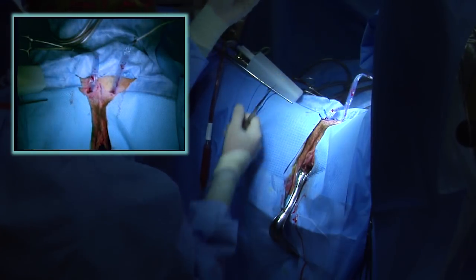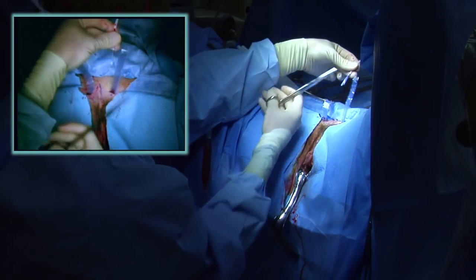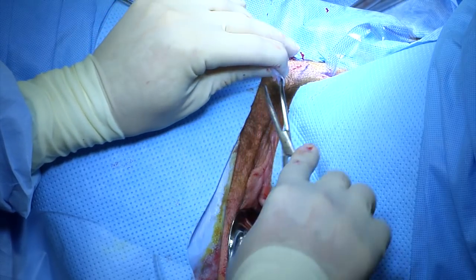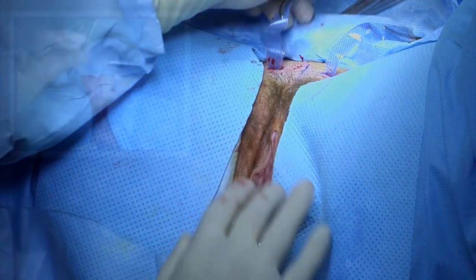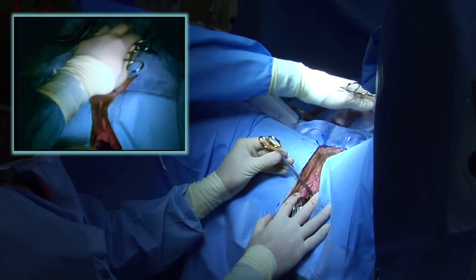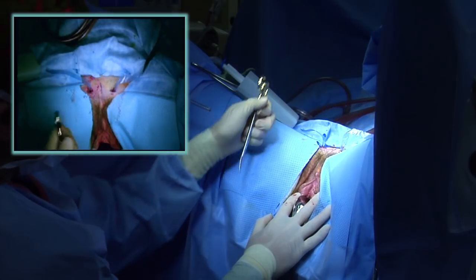Cut the implant bilaterally, close to the trocar sheaths, and clamp the implant sheath while being careful to avoid clamping the implant. Place a blunt instrument, such as scissors or forceps, between the urethra and the implant to stabilize the implant during implant sheath removal.